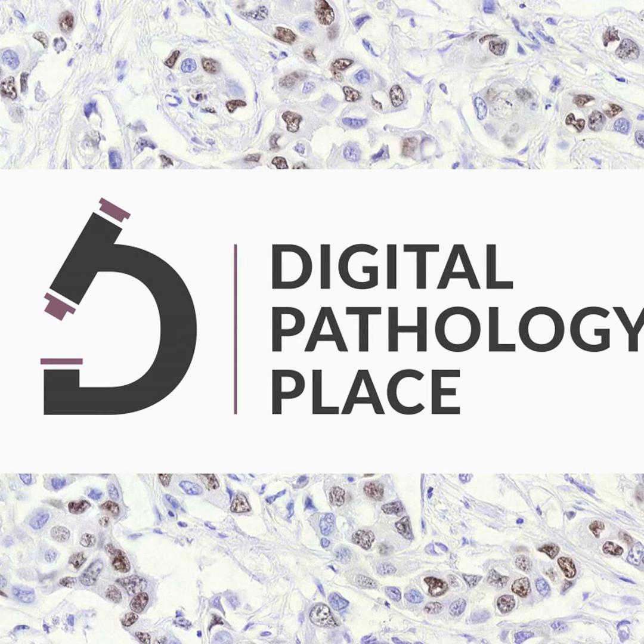Because now if you train a model and someone else trains a model, how do I guarantee that those 2 models are performing the same? You can't. Unfortunately, if I have to train that model, I would have to train a model for breast tissue, brain tissue, prostate tissue, colorectal tissue. And how do I get all of this data? How do I ensure there's enough variability in the data? Then you have this problem where I need every single slide ever created in the world in order to train a model that's robust enough to address it. So we simply avoid that to begin with.